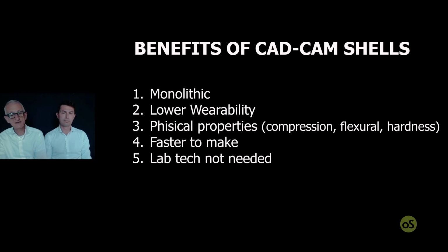The second advantage is the low wearability. This is due to the particular properties of this material, that in some cases, some of these materials have really a very low abrasion rate. Physical properties are better in some of these materials. They need less time to be manufactured, and lab technician often is not required.